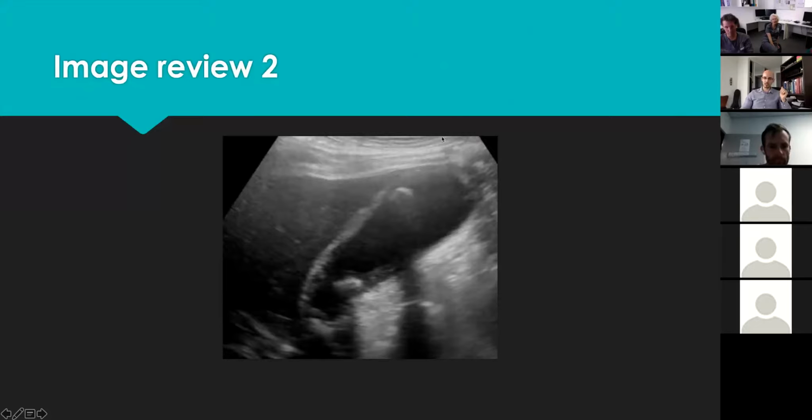We get a perpendicular area, for example, where the gallbladder wall is completely perpendicular to the ultrasound beam, and measure it so that our accuracy would be to the point of the vertical resolution of the ultrasound, which is much better than its horizontal resolution.